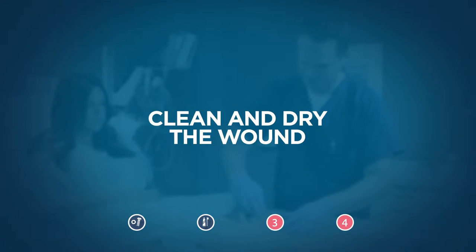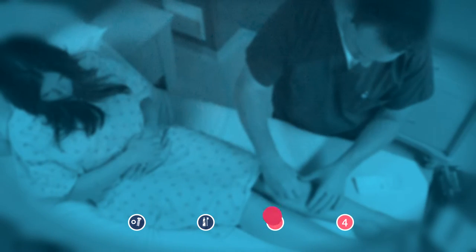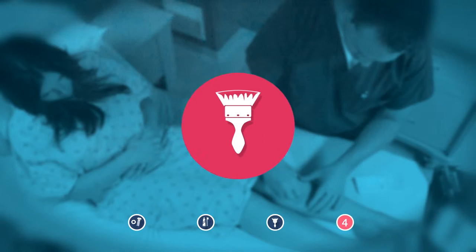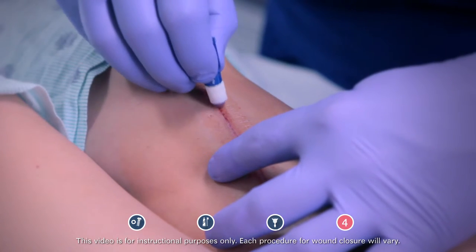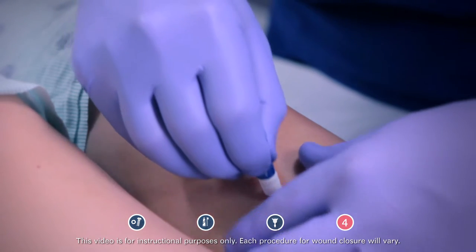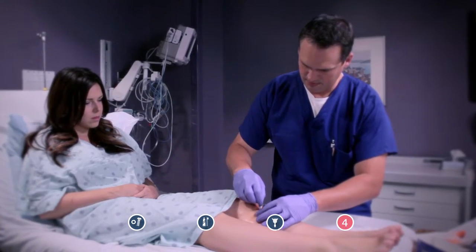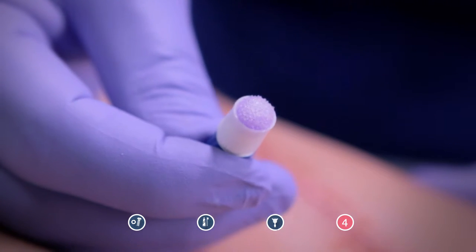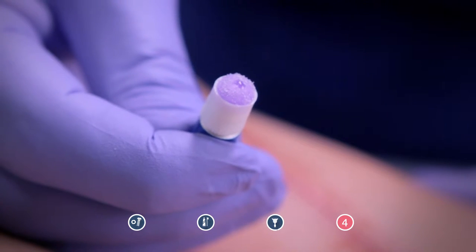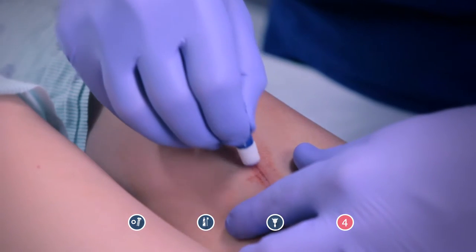Once you have properly cleaned and dried the wound, you are now ready to apply. Holding the flat portion of the tube, begin painting in a back and forth motion until the incision is covered with a smooth layer of adhesive. If the applicator sponge begins to turn white while you're covering the incision or trauma area, turn the tube upright and squeeze until you see another grape snow cone. Start applying again without squeezing the tube.